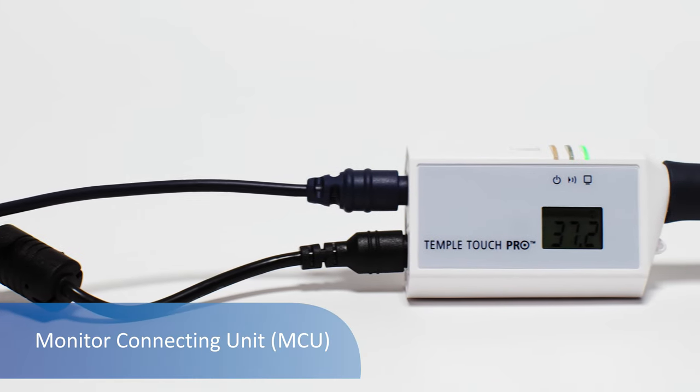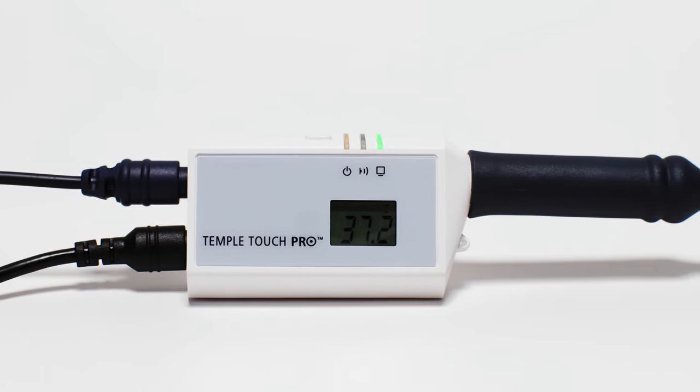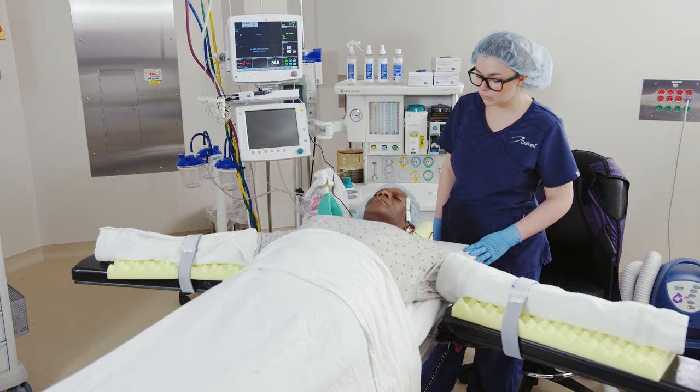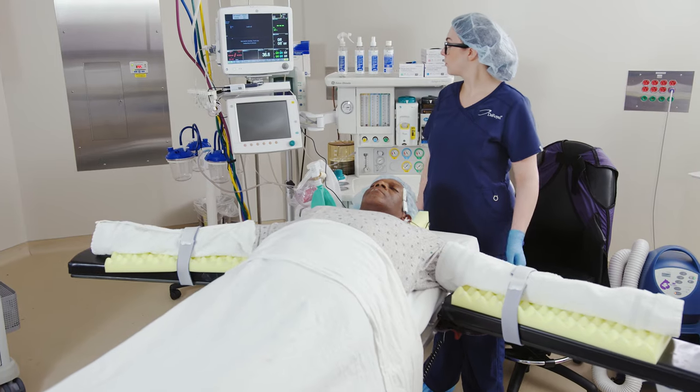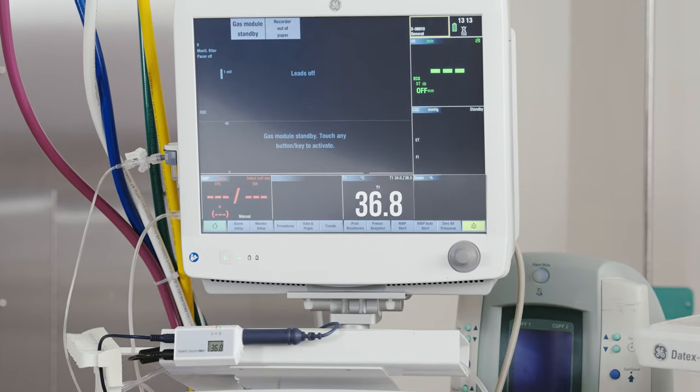The MCU receives data from the sensor and uses an algorithm to calculate and display the patient's core temperature. If attaching to a patient monitor, the patient monitor will display temperature and connect with the facility's EMR system.